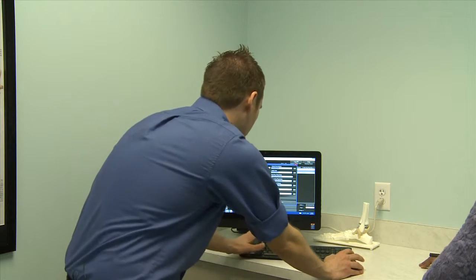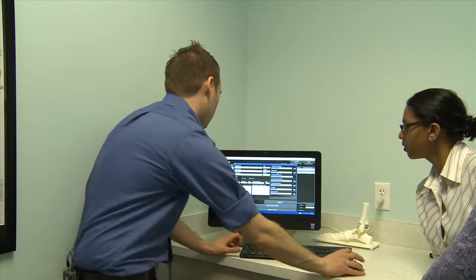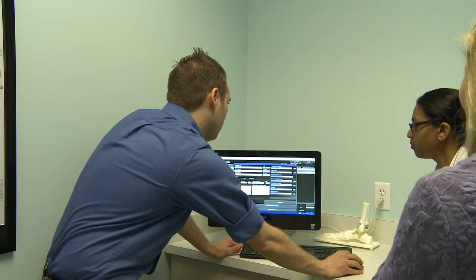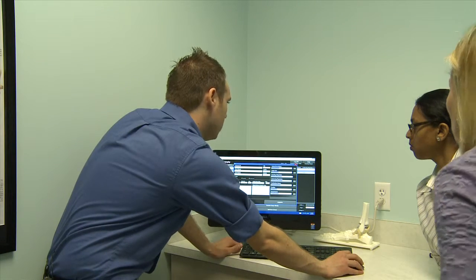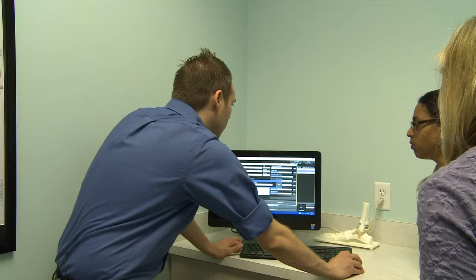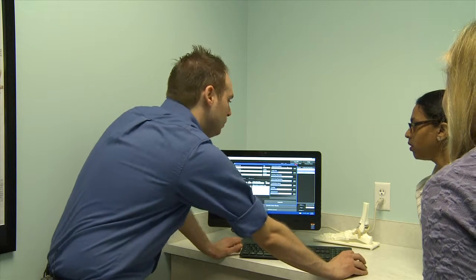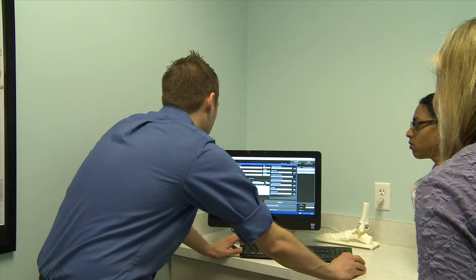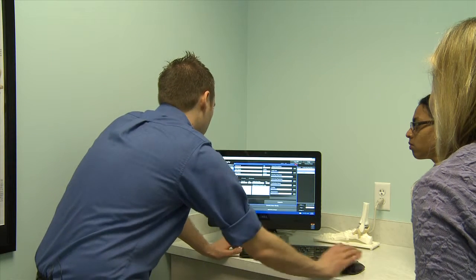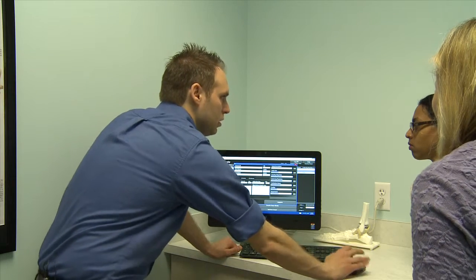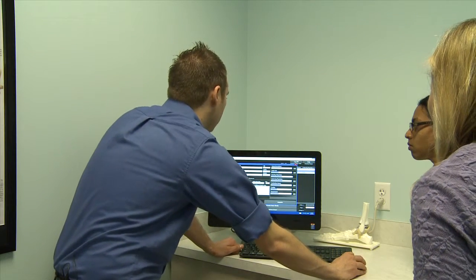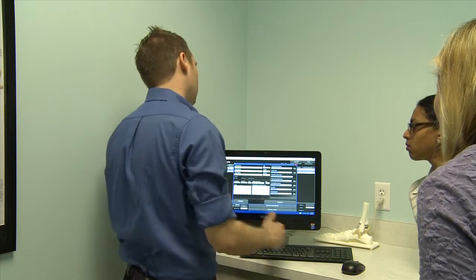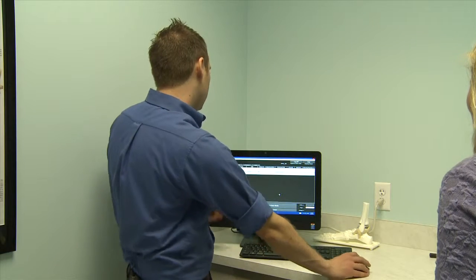On the right side you have a Study Description field — that's where you'd add pre-op or post-op notes, and it will save as an option. When you type a patient ID in the study list, once you click away it automatically searches, finds the patient, and fills in their information — saving you time.